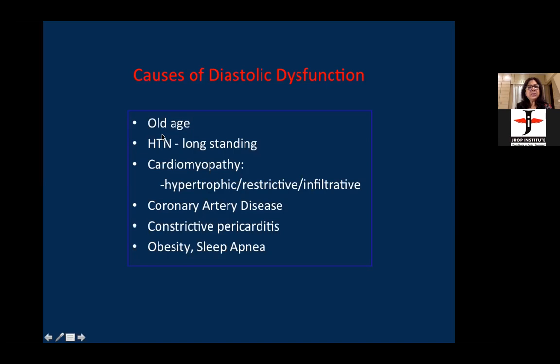So in a patient of more than 60 years, you may get a mitral inflow pattern showing impaired relaxation. But if that impaired relaxation pattern you are getting in a young man of 35 years, that is not normal, that is abnormal. So while assessing the diastolic function, the age factor should be kept at the back of the mind. Impaired relaxation pattern is a normal finding at old age. You must be aware of the age.